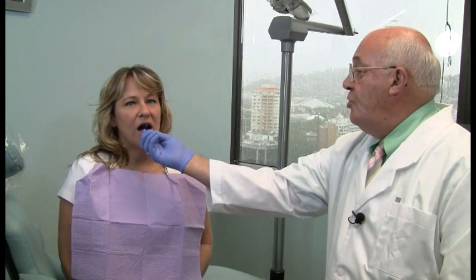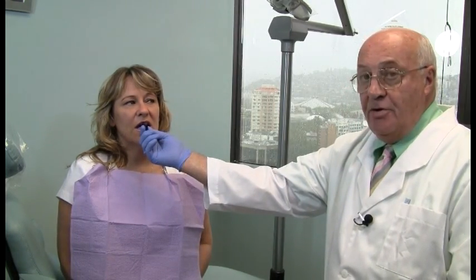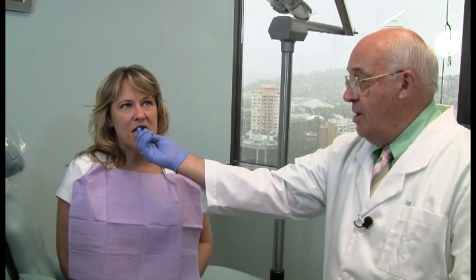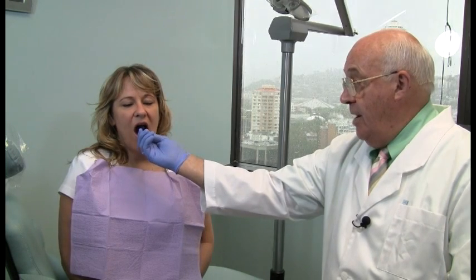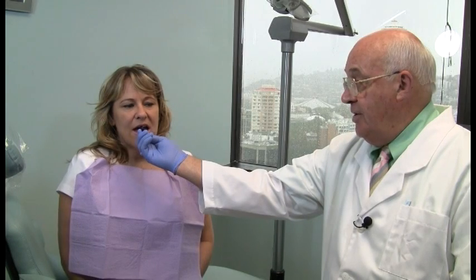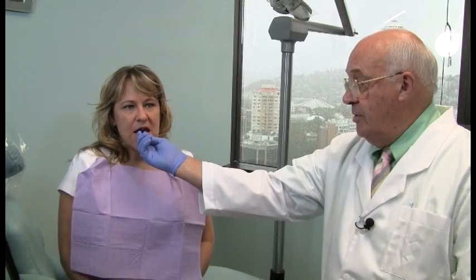Now let's go to the 8 millimeter, and she's at end to end at 8 millimeters. Go ahead. Okay, that's about a 4, all the way forward. Go. That's barely. So that's just about a 1 or a little less. And now just close. End to end at 8, 12. And slide all the way forward at 12. Okay, no snoring there. So maximum forward at 8 millimeters, there's no snoring.